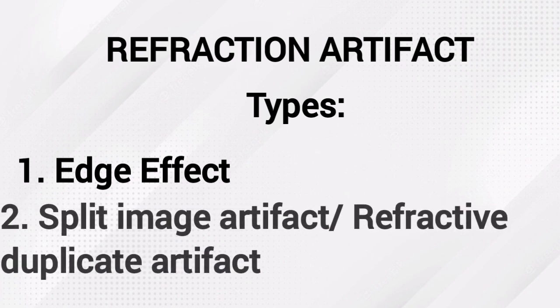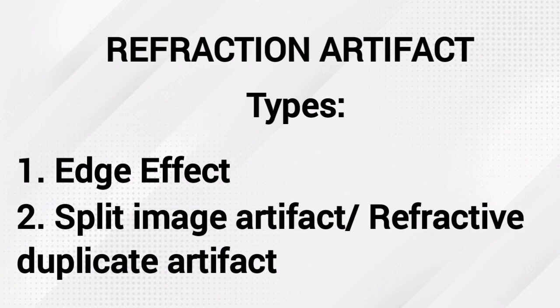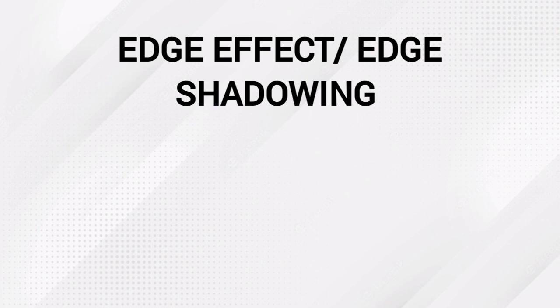The other type involves displacement of a distal structure by more proximal refraction of the beam, and this is called split image or refractive duplication artifact.